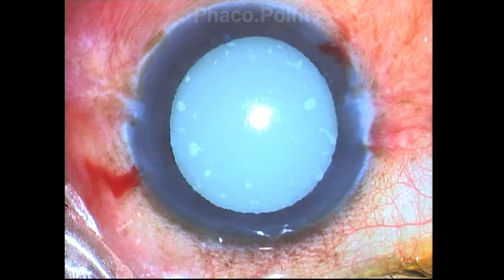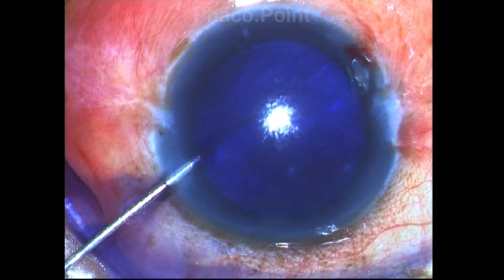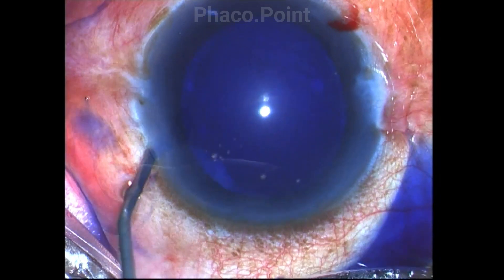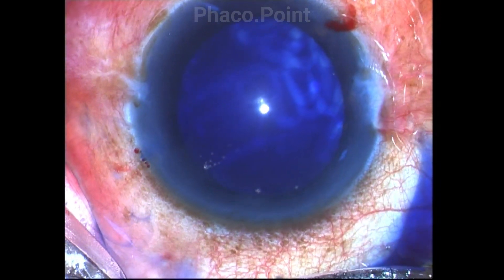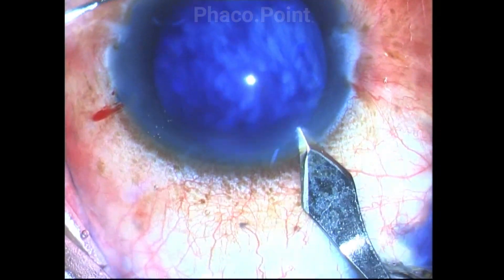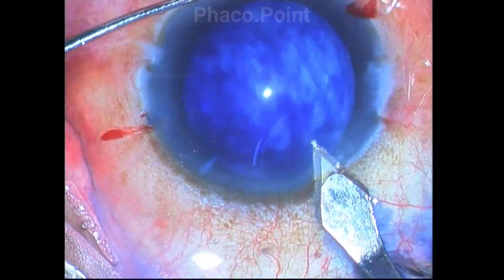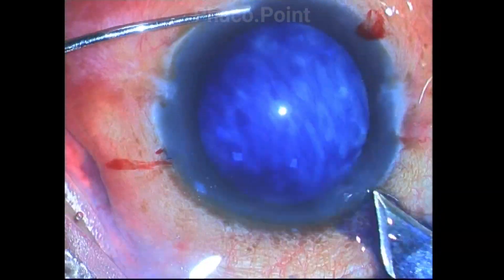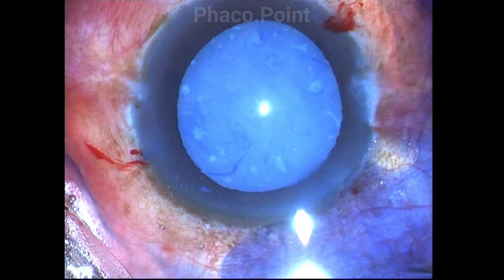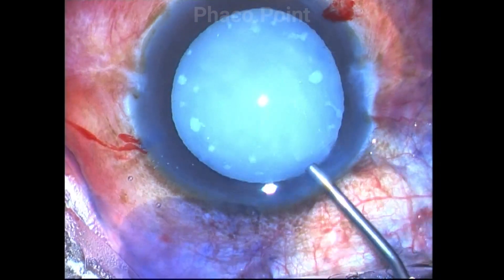Let's see how I manage this case. A little bit of trypan blue is introduced into the anterior chamber to adequately stain the anterior capsule. The clear corneal incision is well constructed. The main pressure point in this case is to successfully complete the capsulorexis as well as manage the hard nucleus.